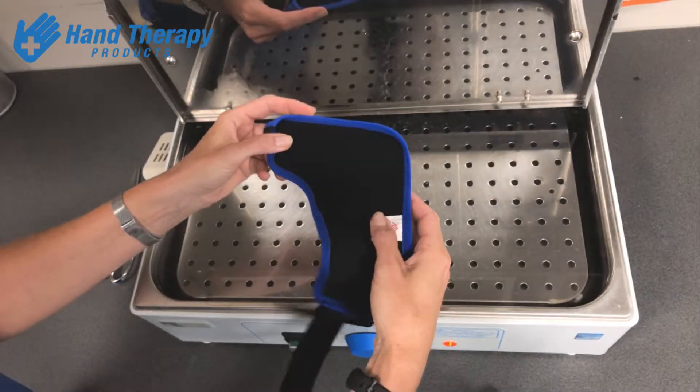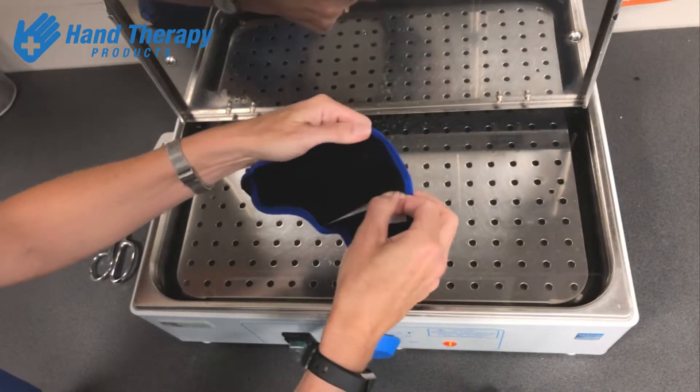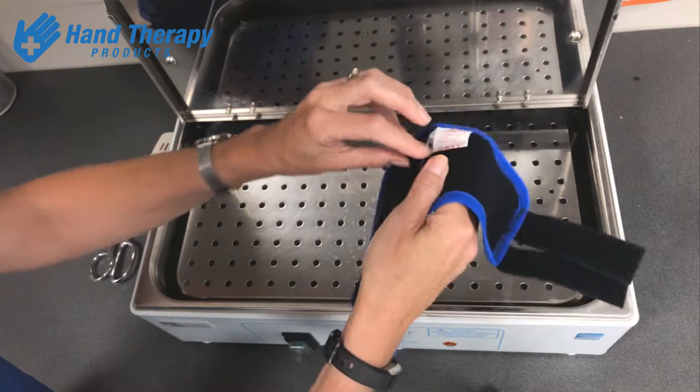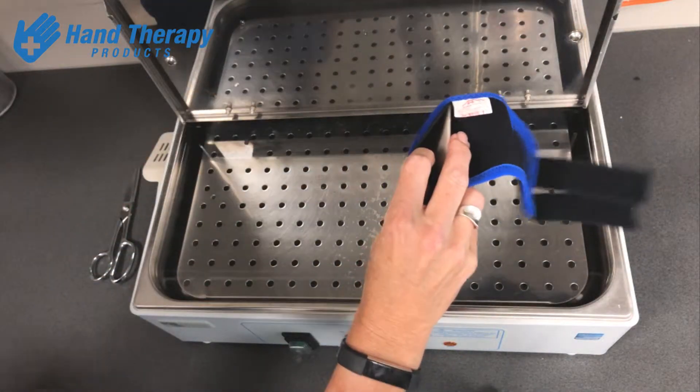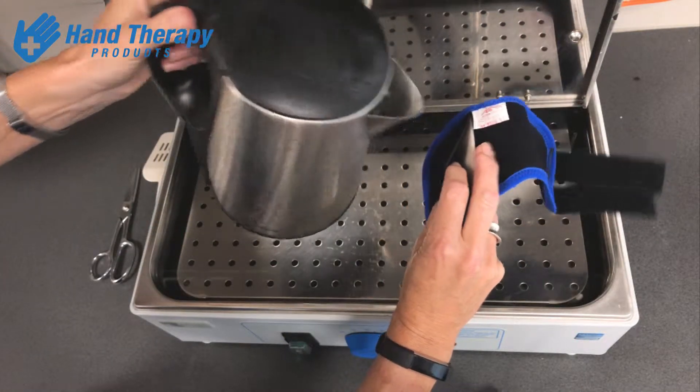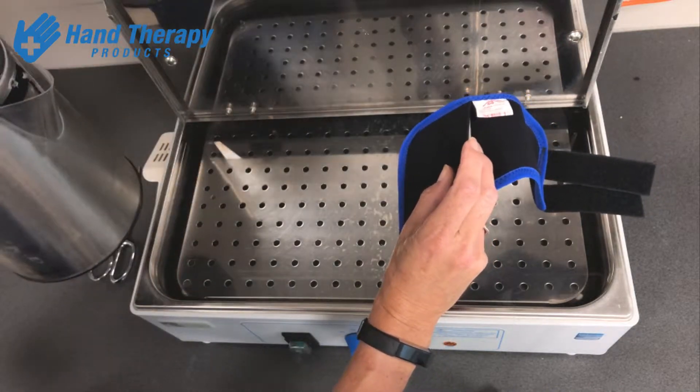I want to show you a handy tip for any splint that's got a thermoplastic insert that you can mold. If you look at the instructions, it'll tell you to open the little pocket and use hot water from a jug to pour into that pocket to melt that plastic and then mold it onto the client.